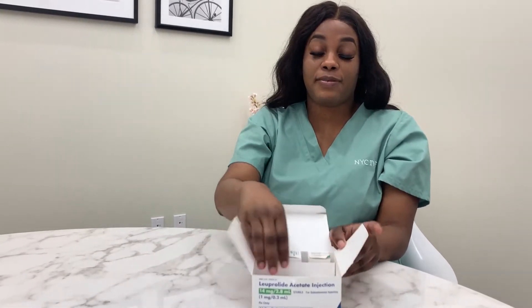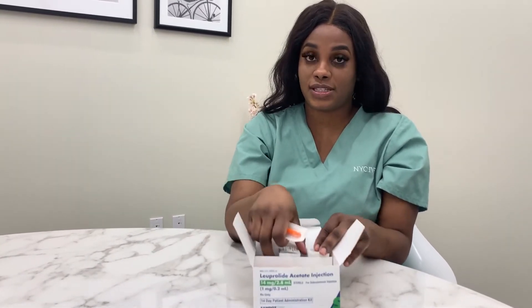Today I'll be showing you the Lupron. Lupron can be used in an IVF cycle, for a trigger shot, and also for FET prep. Our doses of Lupron range from 5 units to 20 units for the trigger.